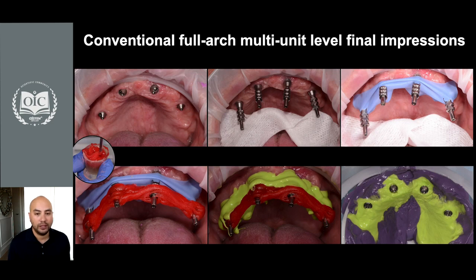Then we use polyether impression material, light body, and a custom tray or an implant impression tray to take the final impression.